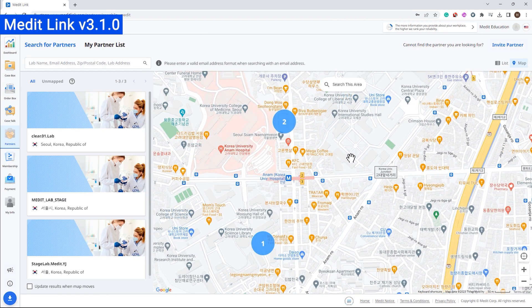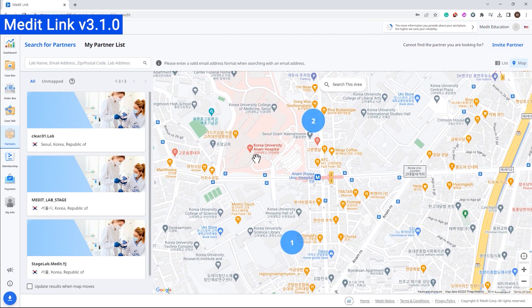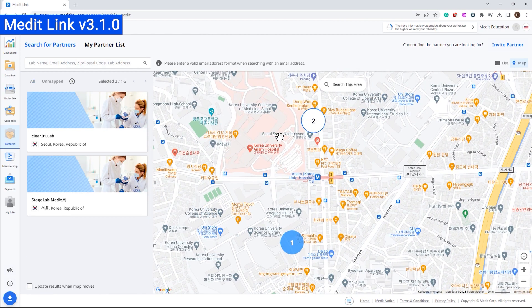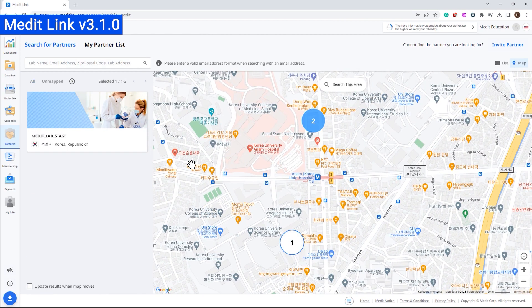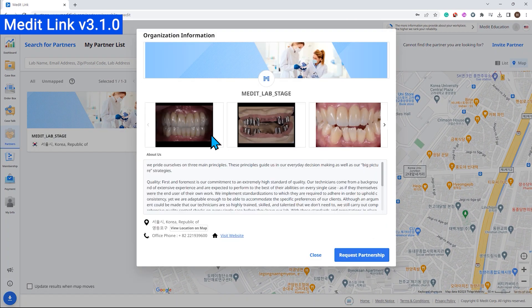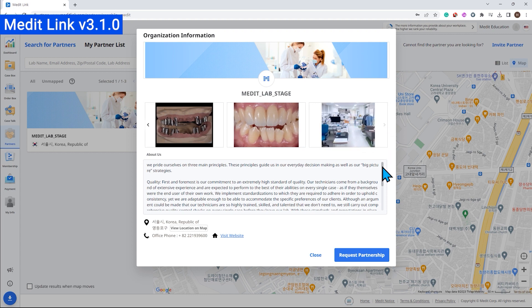Moreover, learning more about partners is now easier with the new interface of the organization information dialogue.